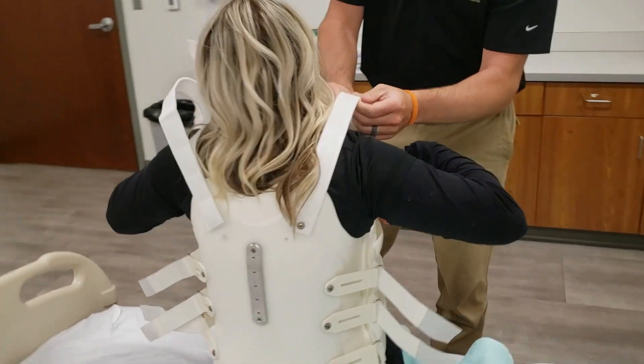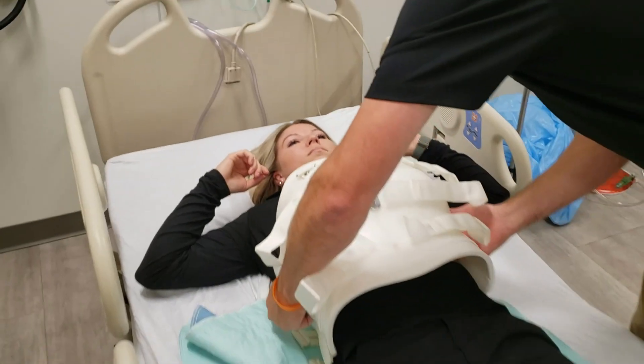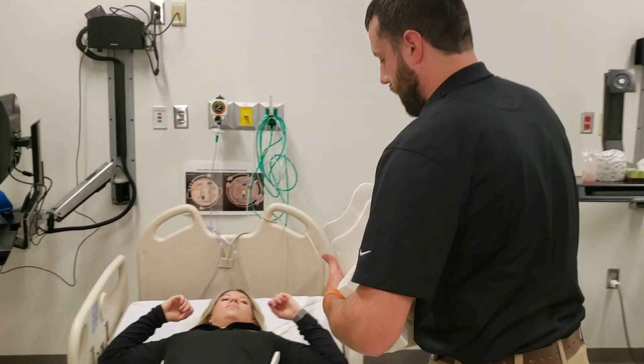Taking it off, you'll do the exact same thing, all in reverse. For questions on wear schedule and how long the patient needs to continue wearing the device, please defer to the referring or treating physician.